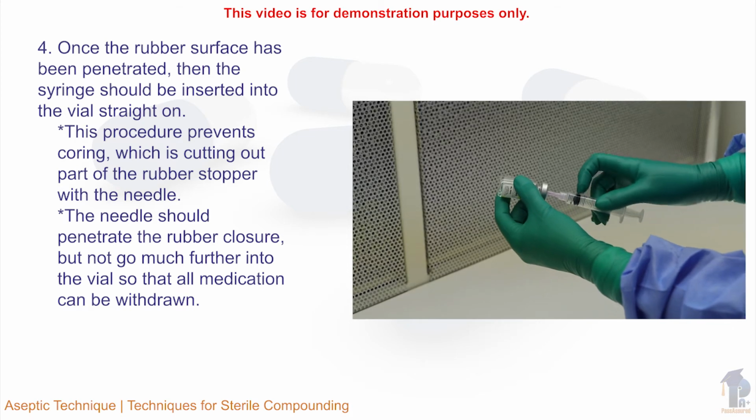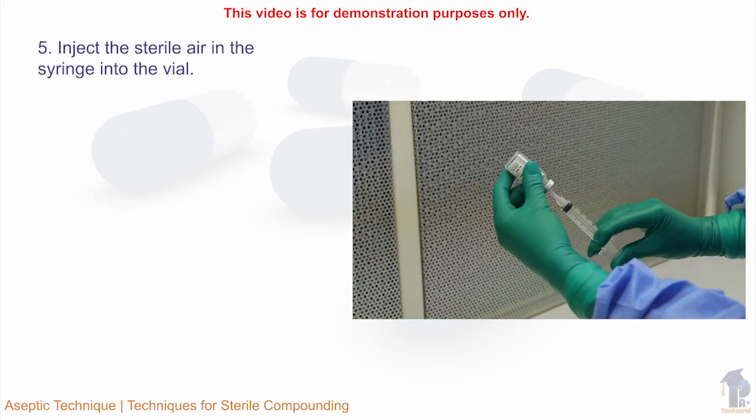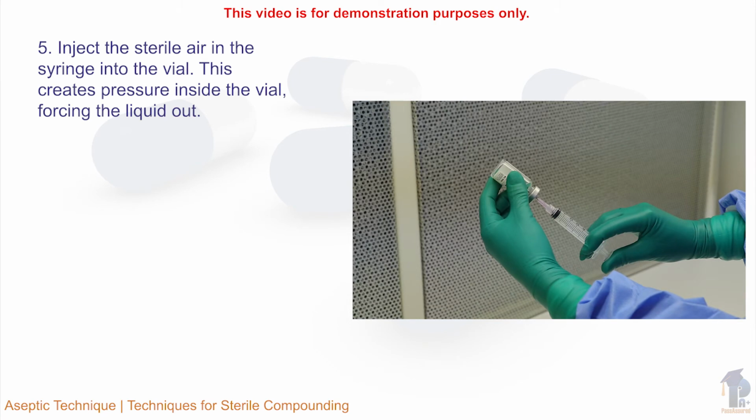be withdrawn. Inject the sterile air in the syringe into the vial. This creates pressure inside the vial, forcing the liquid out.